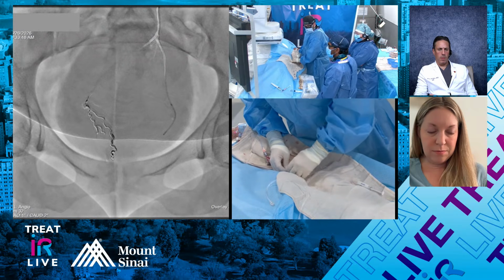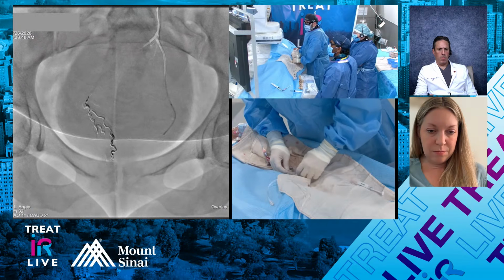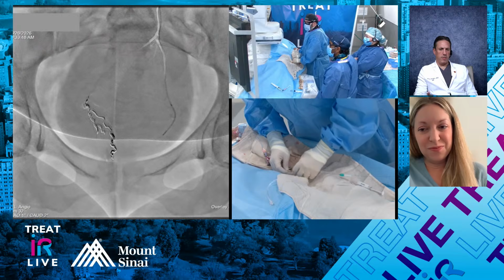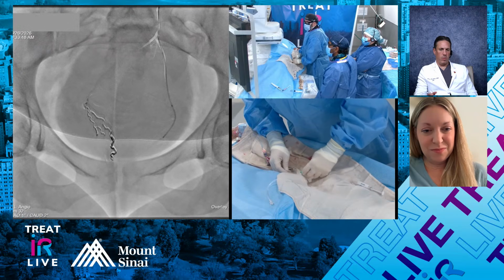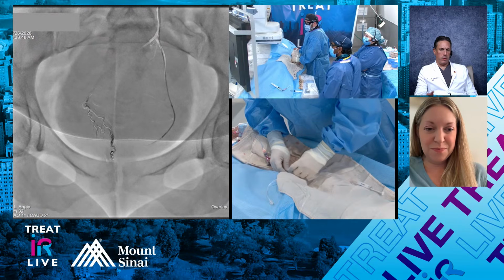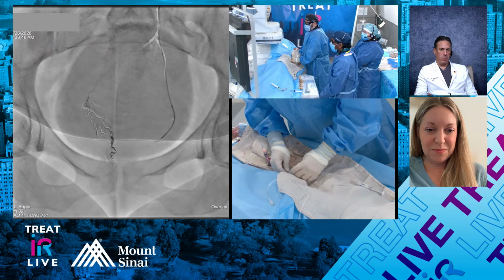I think it's really important for the audience to understand how small and how difficult some of these vessels are to navigate, and you guys are really expertly navigating them with a 2-4 microcatheter, which I think is very impressive.